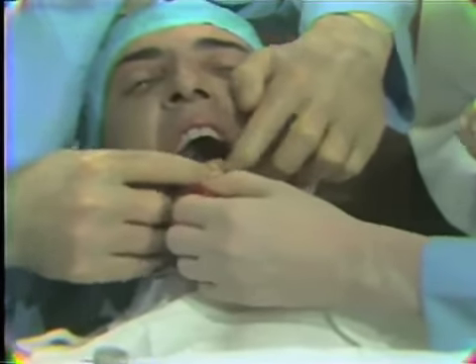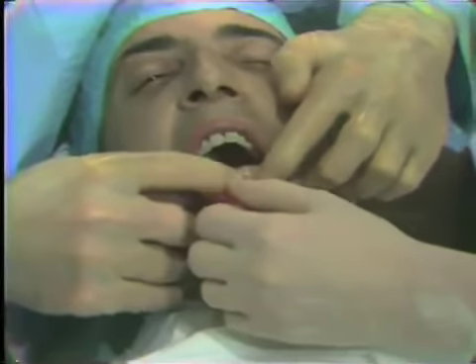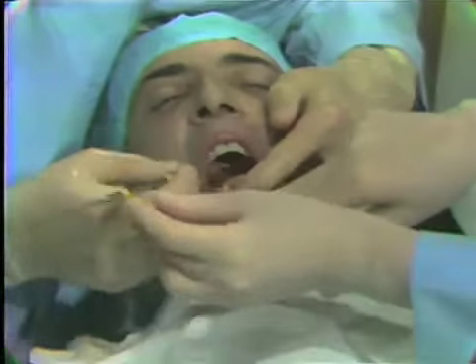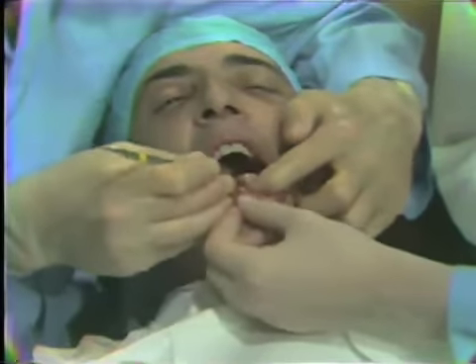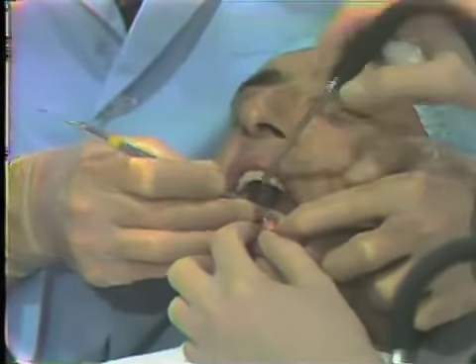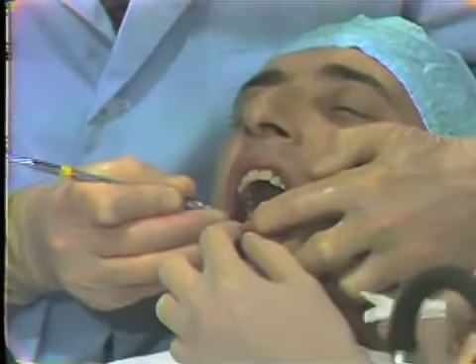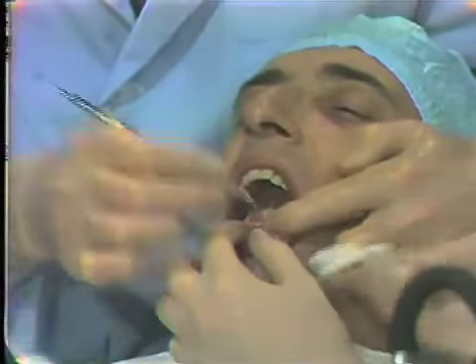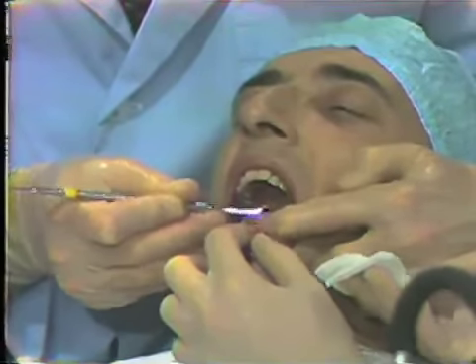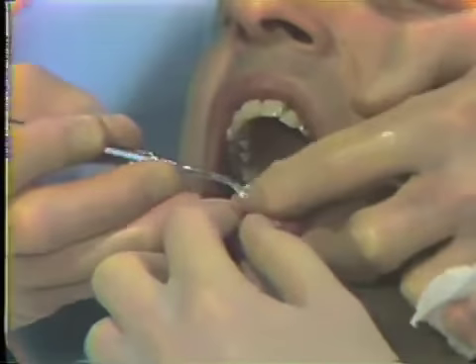As our assistant retracts the lip or cheek and stands by with the plastic instrument, we can again manipulate the dressing so that it is carried to place, utilizing again the embrasure spaces for retention, and any excess of dressing being taken by the gauze sponge that the assistant has. Periodic use of the aspirator tip again helps us to view the interproximal areas so that we can see that the dressing is being firmly placed into the interproximal areas.